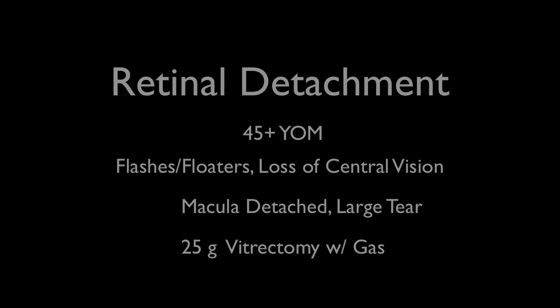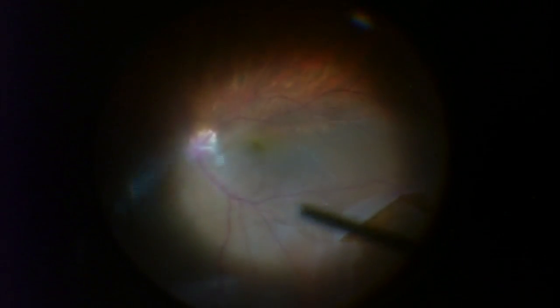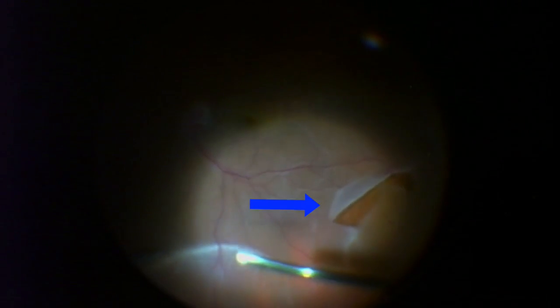It was repaired using a 25-gauge vitrectomy. Of note, there is a very large tear, which you see in the lower right, and his macula is detached, which explains why his central vision was lost for about four to five days before he came in. The upper blue arrows show the area of detachment, and the red arrows show the area of the macula, which gives you your central vision. The blue arrow in the lower right indicates the rather large retinal tear, which leads to this retinal detachment.